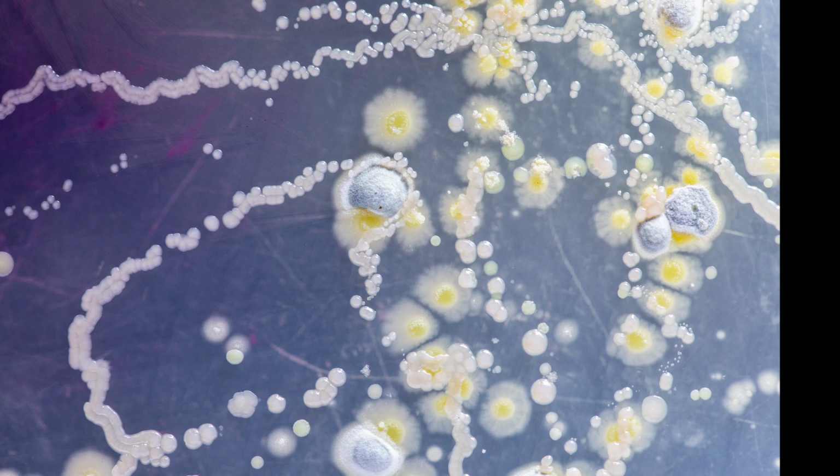If you have gaps between streaks or patterns from streaking the plate, or if the growth is too light, it is usually very difficult to decide if you have a fuzzy or a sharp zonage. That happens from time to time for us in the EDL, when people in the routine work stop by with a plate with enterococci and vancomycin, and they say, should we regard this zone as fuzzy or sharp? And we would say, actually, we cannot say, because the growth is too light or the plate is too stripy. So we recommend that you just repeat the test until tomorrow, streak your plates very carefully, and then we will look at the zone again.